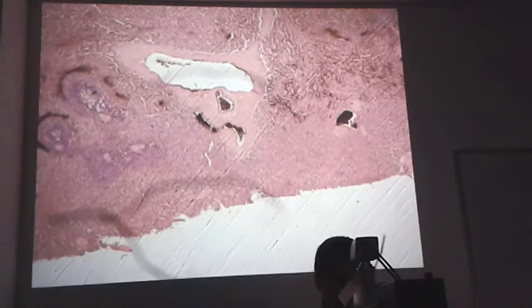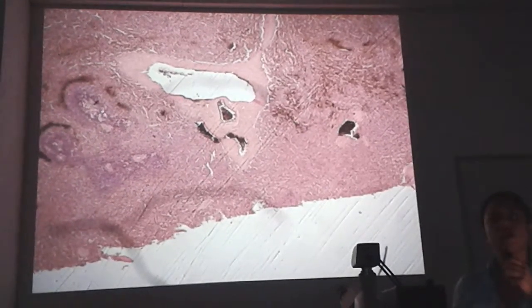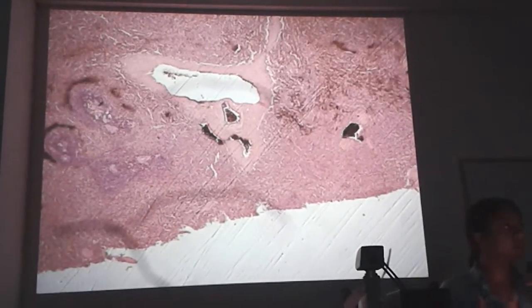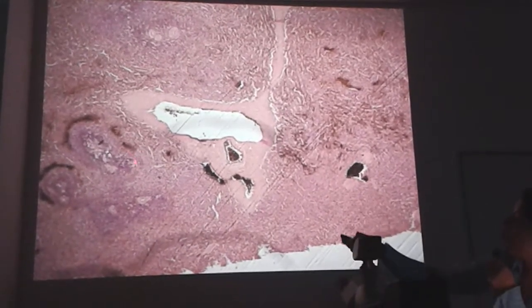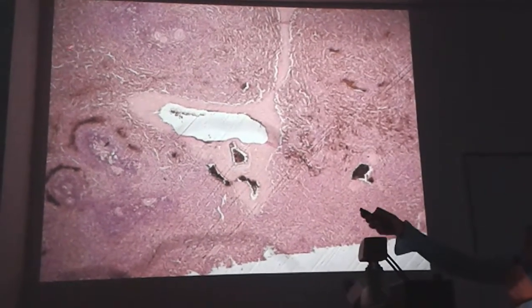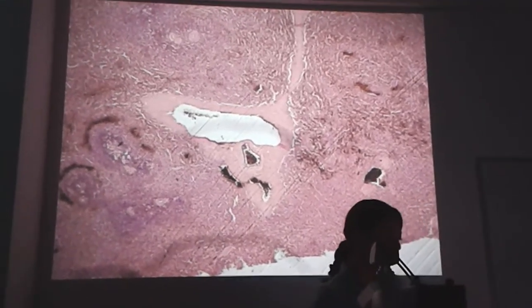When we talk about white pulp, the white pulp is made up from lymph follicles. Okay, so lymph follicles is called white pulp in the spleen. These darkly stained areas are white pulp. See, these areas are all white pulp, and all the other area dispersed in between white pulp is called red pulp. I'll try to find a better area for you.